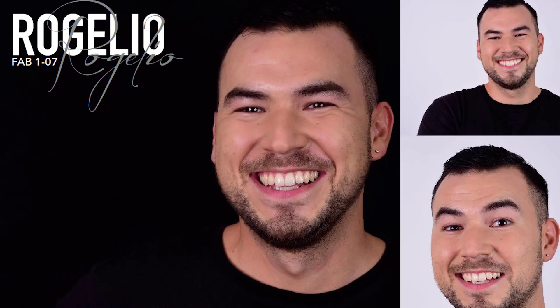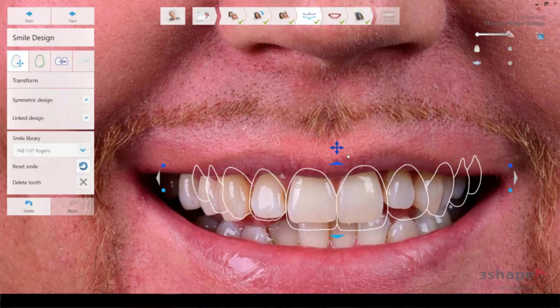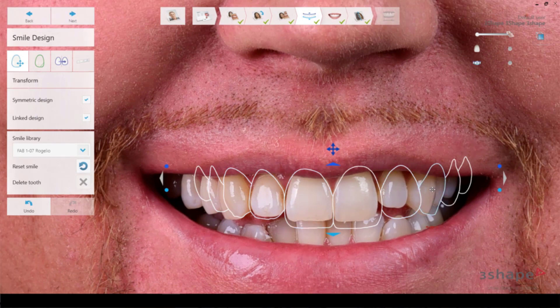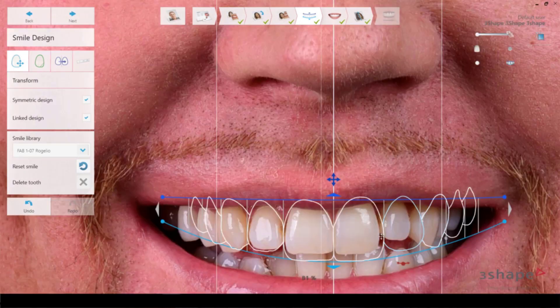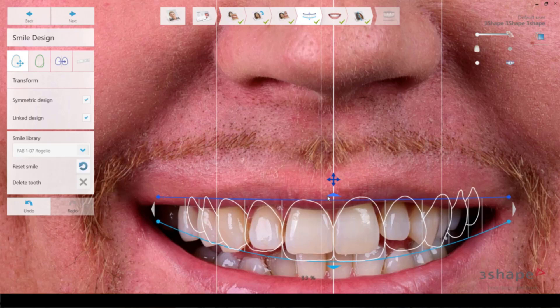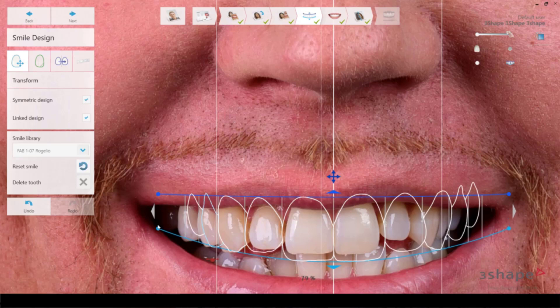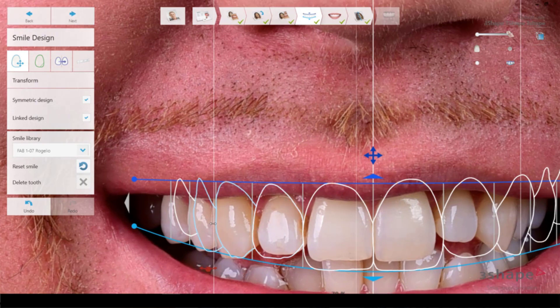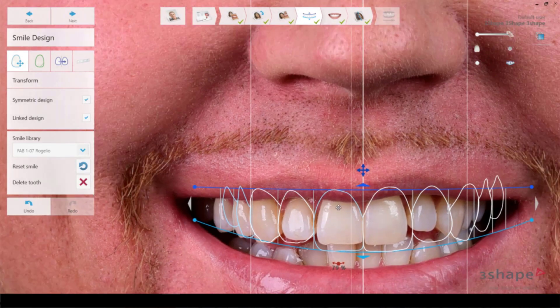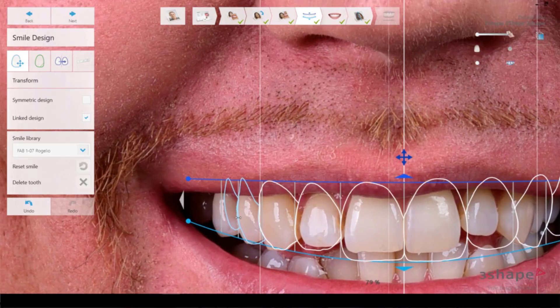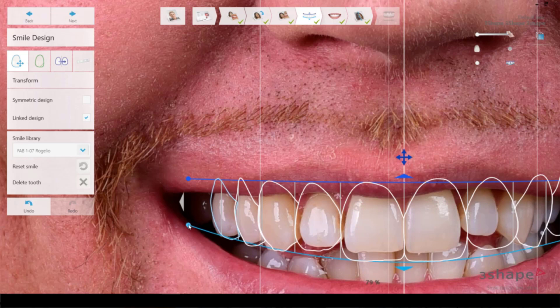I believe Fab107 is something we can work with — it has slightly bigger teeth, and this patient needs a little more length to get a positive smile line. So I choose Fab107 Rogelio and now it's time to position it correctly in the patient's face. As you can see, there's quite a big difference between the right and left side. We can make the teeth a little bigger, a little wider, take down the smile line a little bit. I ungroup it so I can work with one side independently and add a bit more length, and we can also rotate teeth if needed.